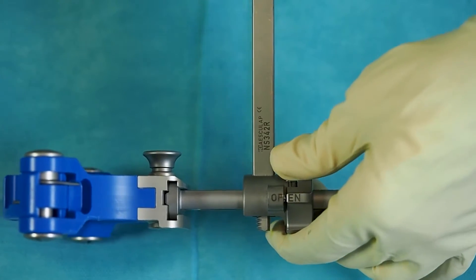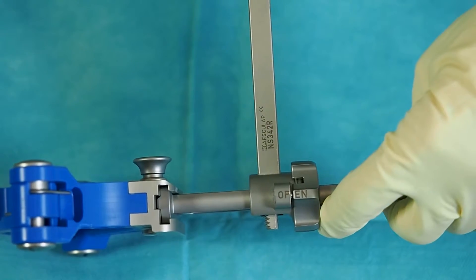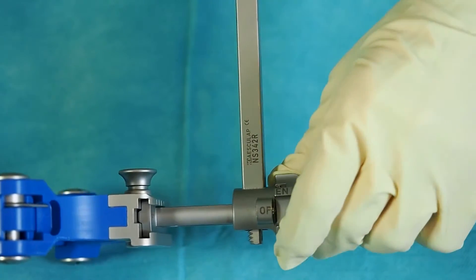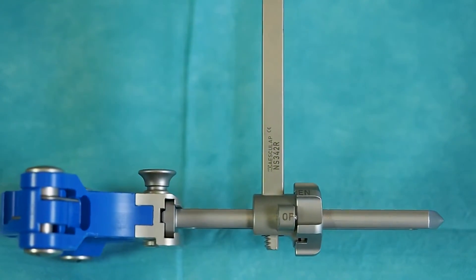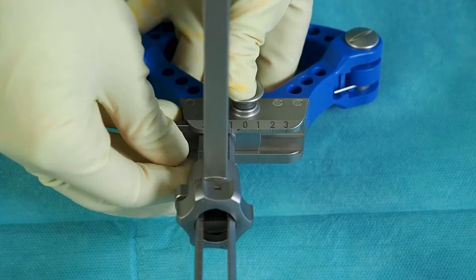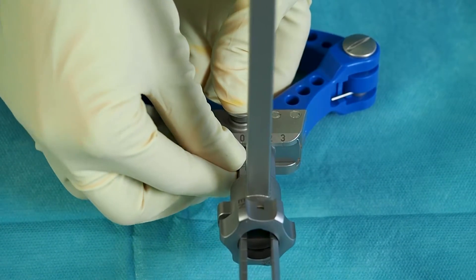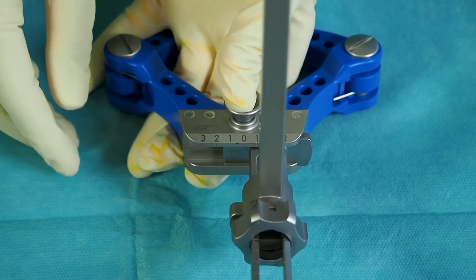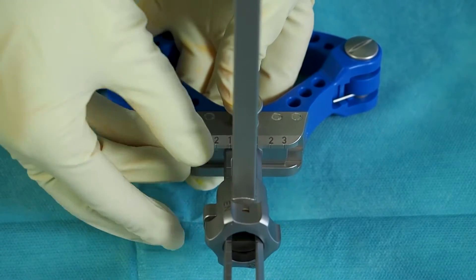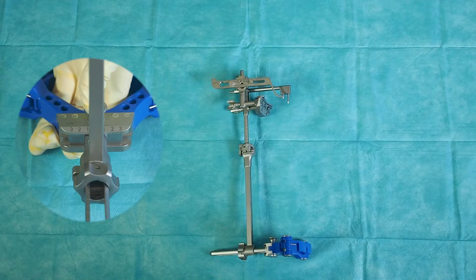By opening the fixation wheel of the handle, the alignment system can be shifted in AP direction in order to increase or decrease the slope of the proximal tibia resection. Pushing the knob at the bimalleolar clamp and sliding the alignment system medially or laterally allows to adjust the varus valgus of the proximal tibia resection. The distance between the laser marked lines on the scale corresponds to a 1 degree adjustment for a 40 cm long tibia.